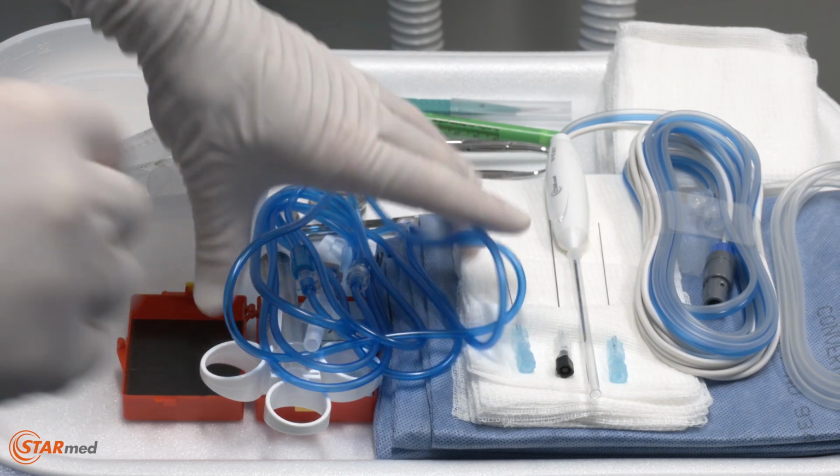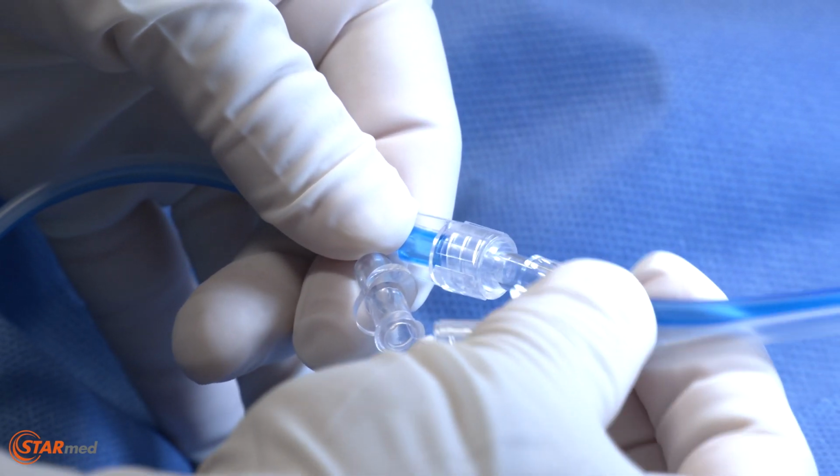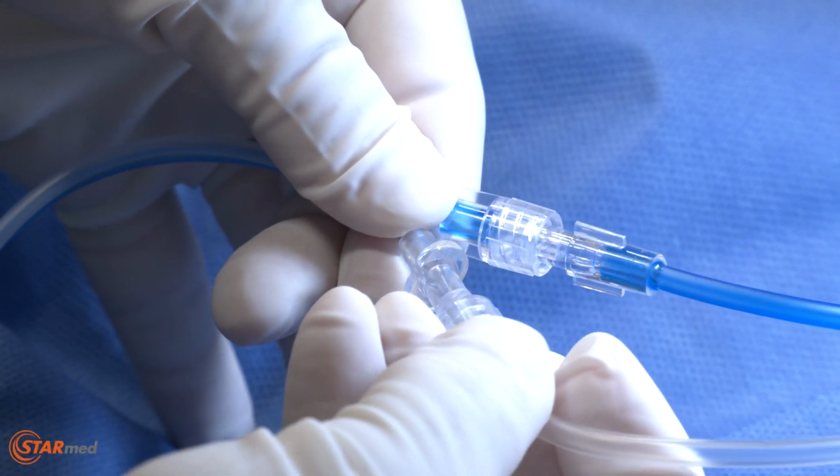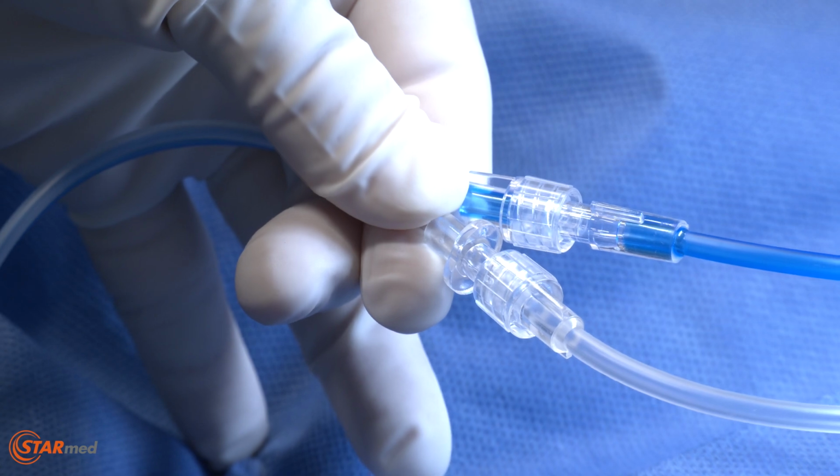Next, connect the tubing to the RF electrode. To assemble the tubing, connect the blue inflow tubes to each other. Do the same for the clear outflow tubes.